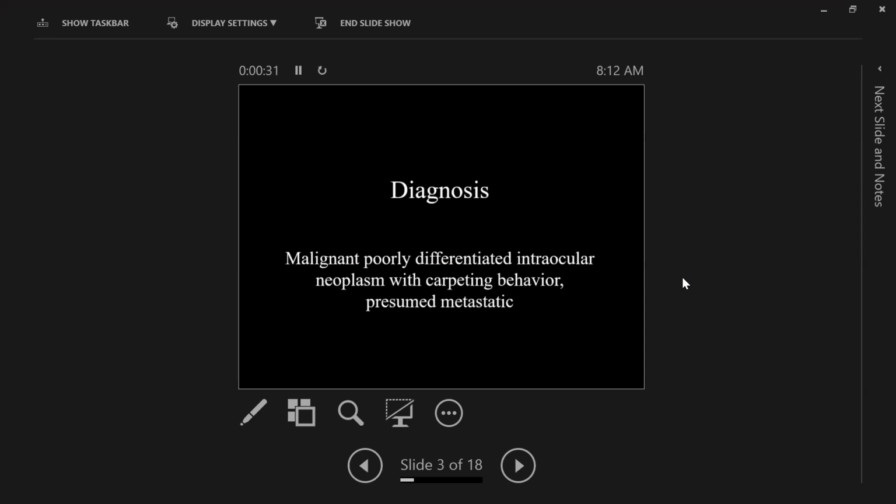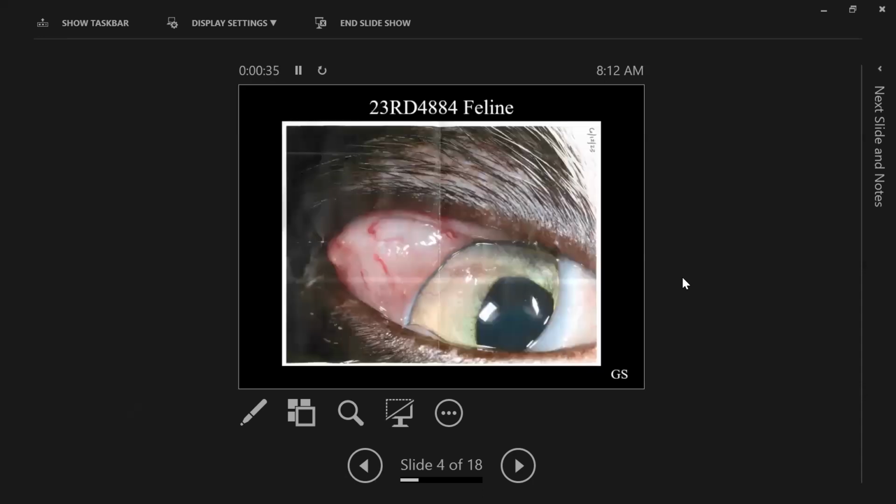The people who are in the room don't know what I'm talking about, but there's Zoom and PowerPoint issues happening, and I'm too much of a goober to fix it. All right. Moving on to the next case.